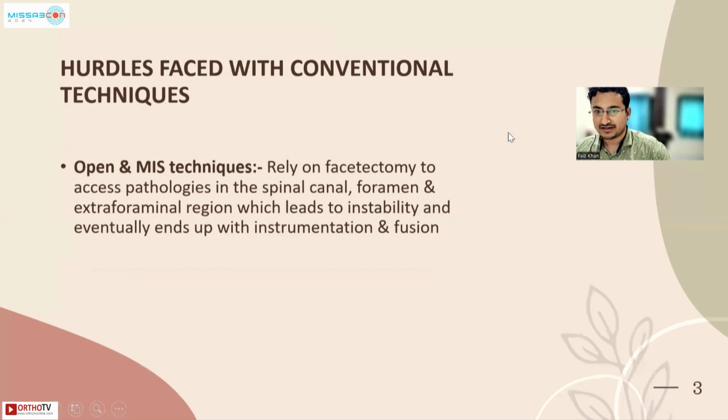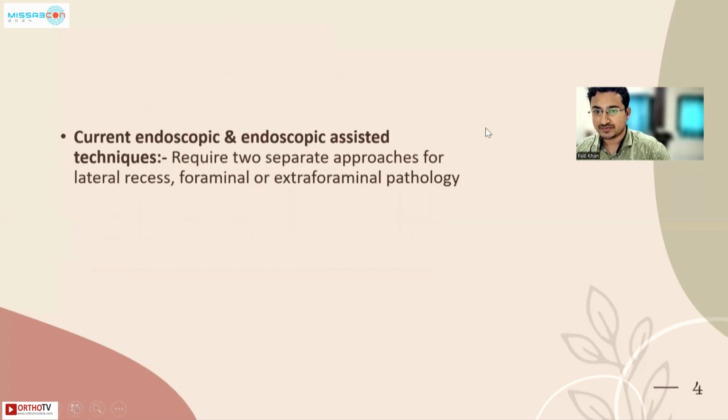Hurdles faced with the conventional techniques: open and MIS techniques rely on facetectomy to access the pathologies in the spinal canal, foramen and extraforaminal region, which leads to instability and eventually ends up with instrumentation and fusion. Current endoscopic and endoscopic assisted techniques require two separate approaches for lateral recess, foraminal and extraforaminal pathology.